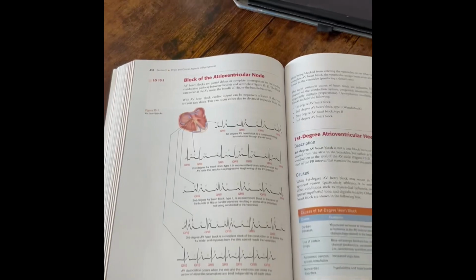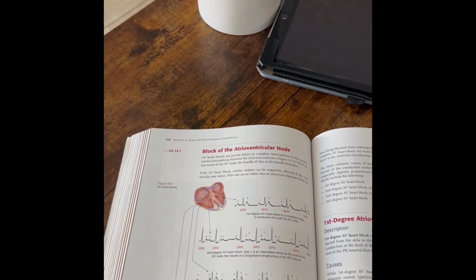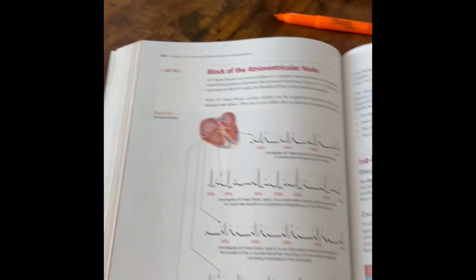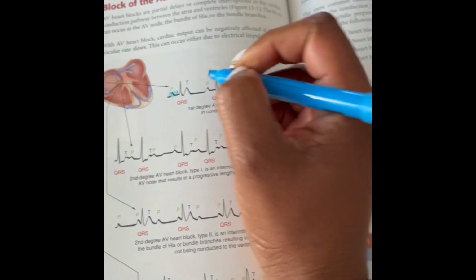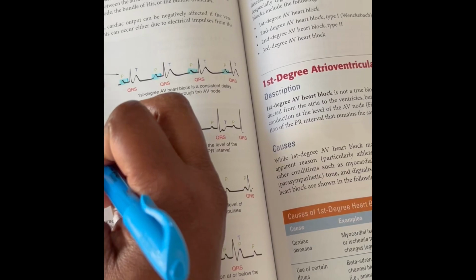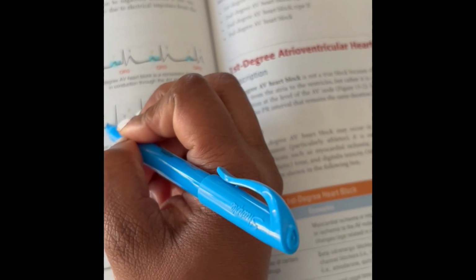I'm going to go into the way I learned to remember. Ready? Okay, so I'm going to do this first. Highlight, highlight all the P waves.